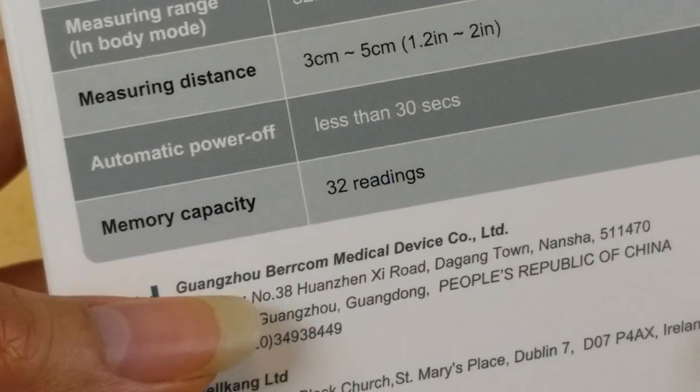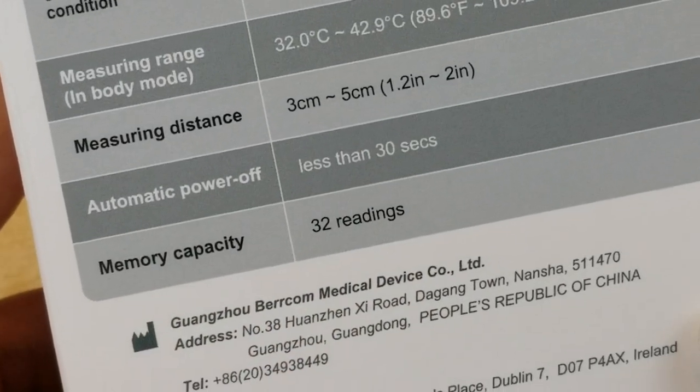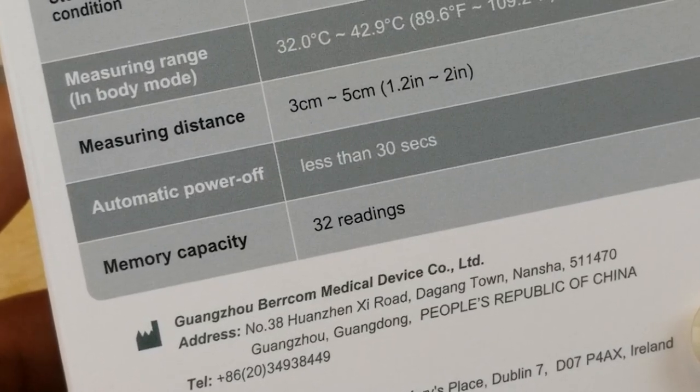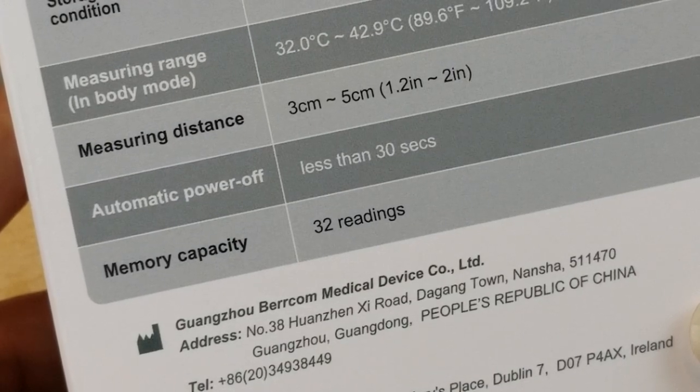Memory capacity up to 32 readings. Automatic shut-off in less than 30 seconds. The measuring distance is 3 centimeters to 5 centimeters, or 1.2 inches to 2 inches.